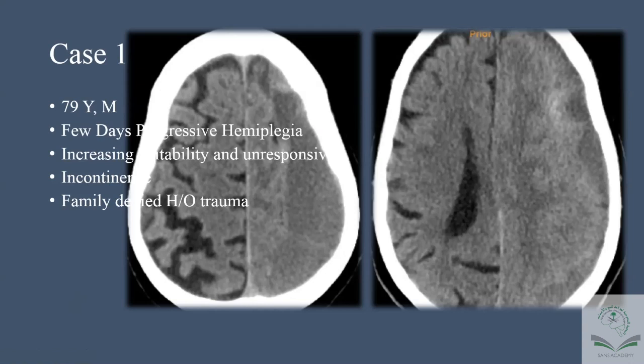Okay, so you decided that this is a chronic subdural hematoma with some septations and a little hyperdensity in the occipital area, which might be an acute exacerbation a few days before he arrived. And you wanted to evacuate it. So why do you want to evacuate? So the patient is symptomatic from it.